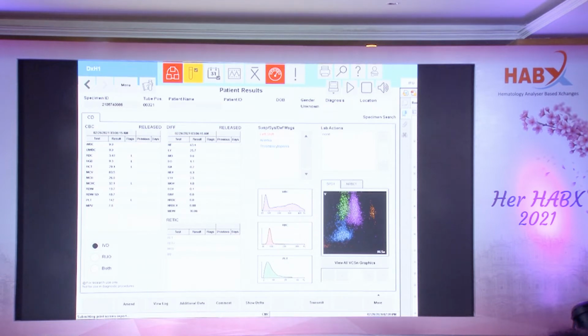So when you have large neutrophils with low scatter, they will start hugging the monocytes. So you must realize one thing. What is being counted as monocyte by the cell counter is not monocyte. They are neutrophils which are large and hypogranular. They are neutrophils which have been produced in less than 1 day. They are neutrophils which happen only during sepsis. That means pseudomonocytosis is a very important sign of sepsis.